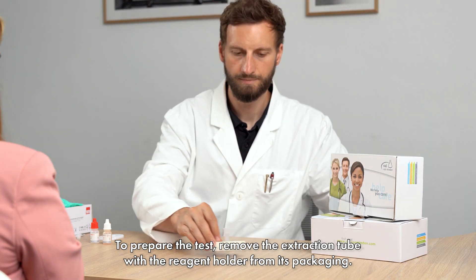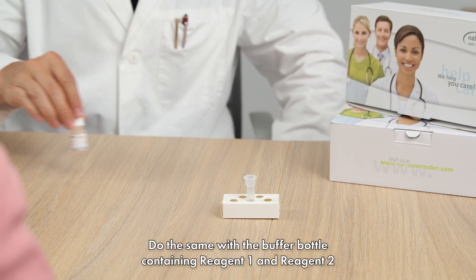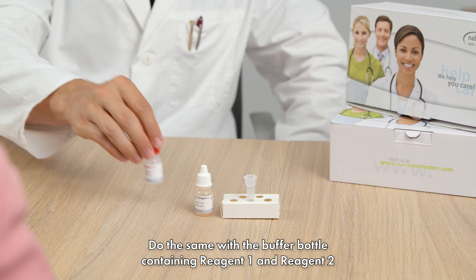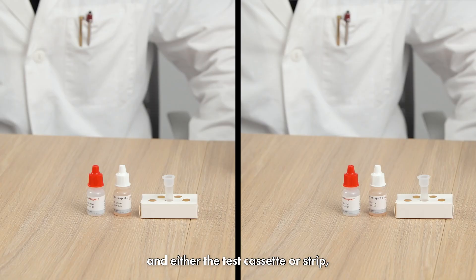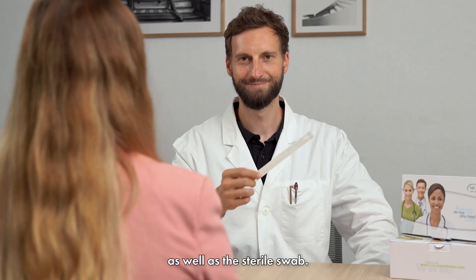To prepare the test, remove the extraction tube with the reagent holder from its packaging. Do the same with the buffer bottle containing reagent 1 and reagent 2, and either the test cassette or strip, as well as the sterile swab.